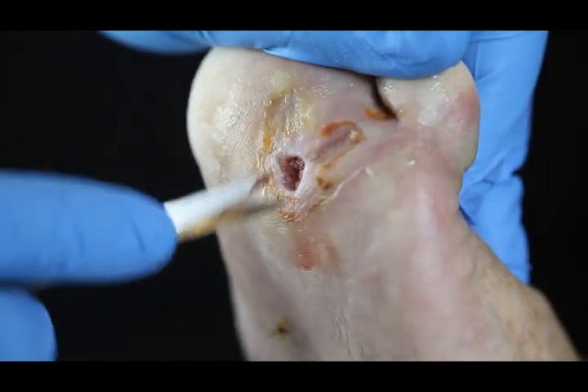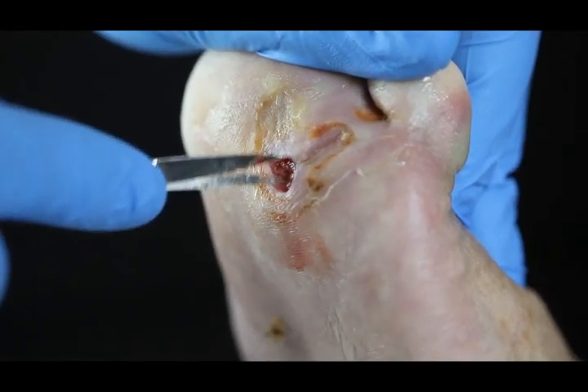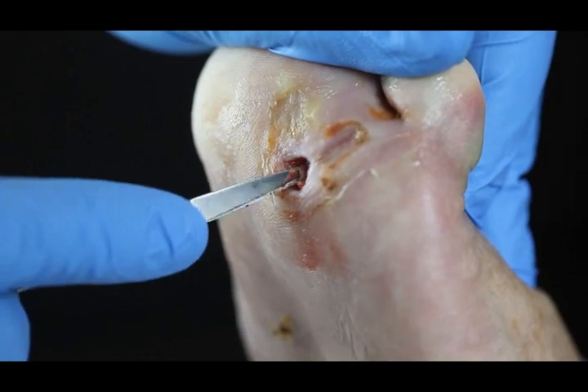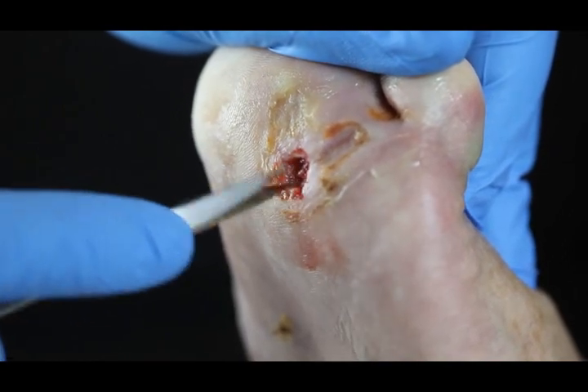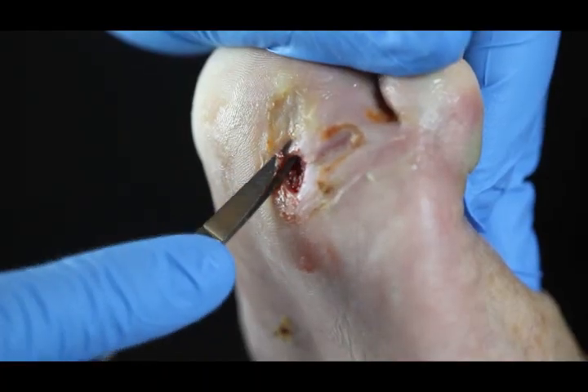Now we're down into host tissue. There are still fragments of biofilm left on the surface of the wound, and we're going to try to suppress the reaccumulation with gels and other topical treatments that we use.